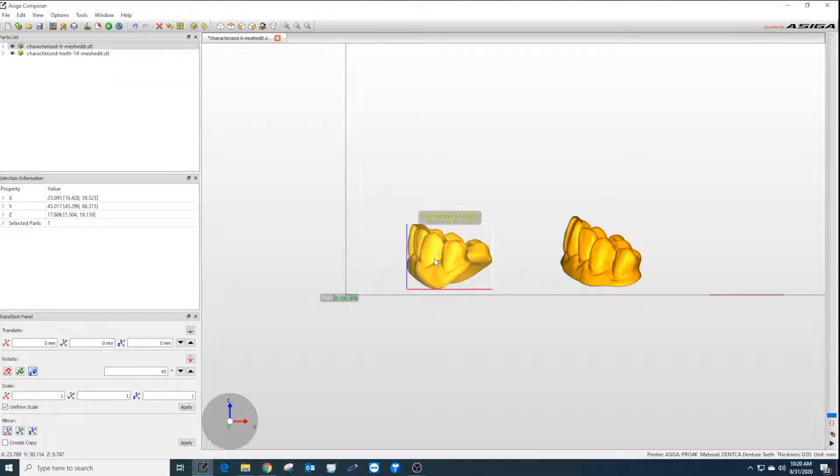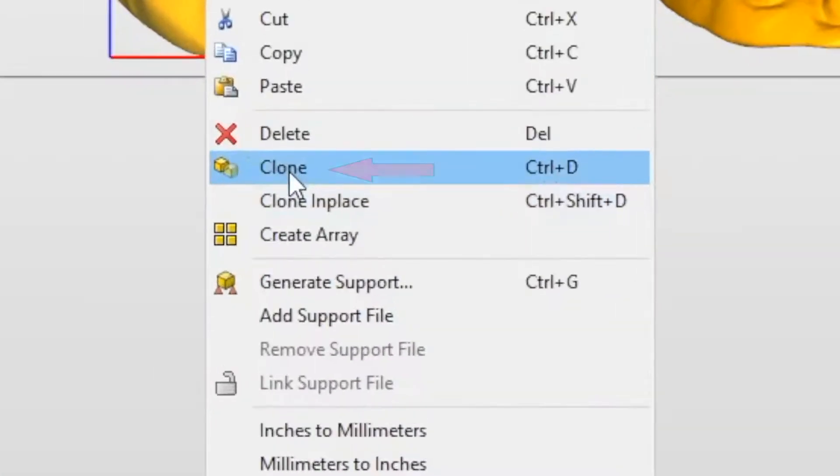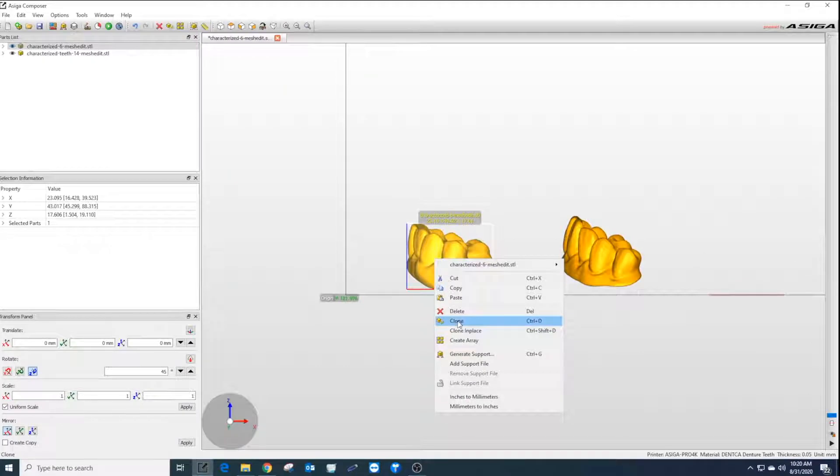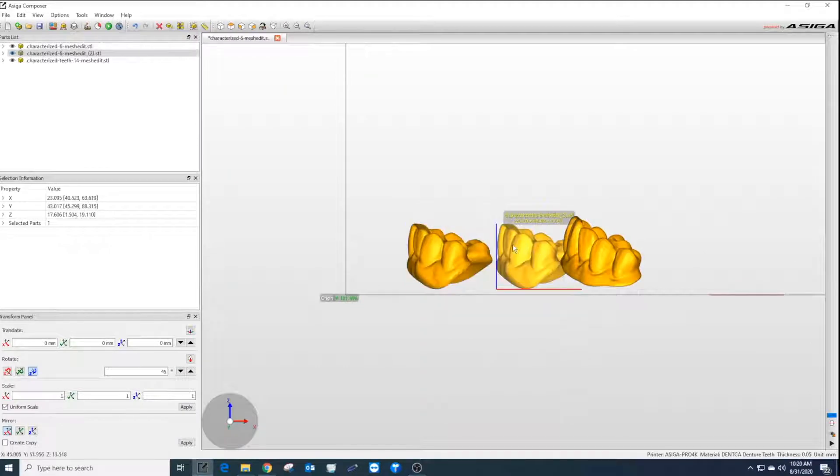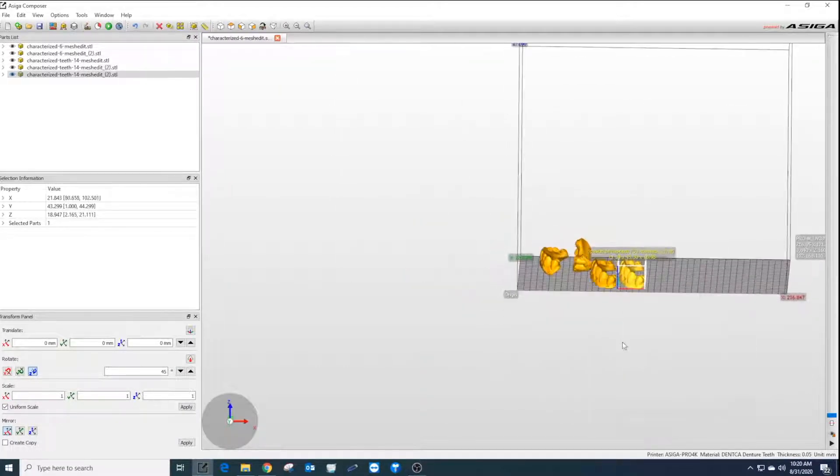If printing more than one set, for each teeth right-click on the teeth and select clone. A duplicate will appear in the builder.